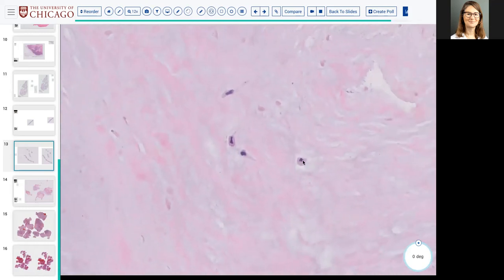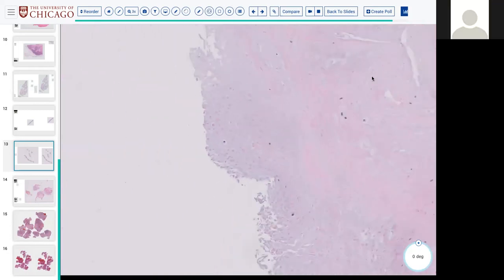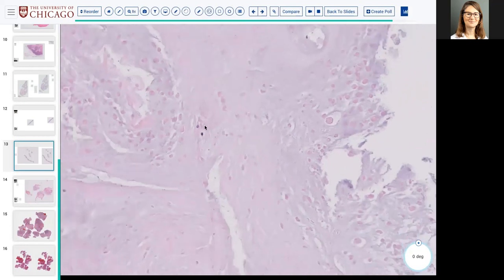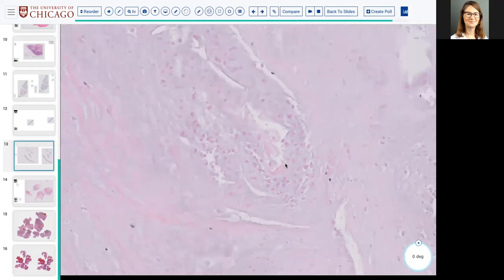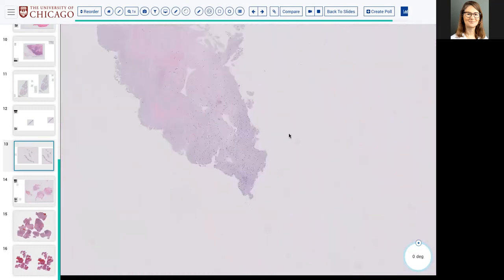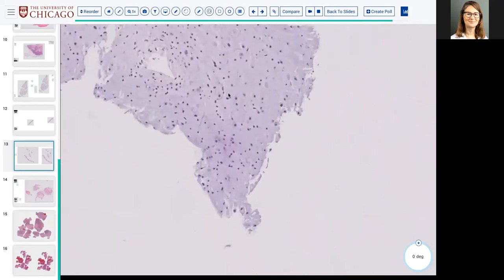And so here's the viable nuclei. And over here is an area where the nuclei are gone. And so these two, of course, are viable, but these pink areas are where the nuclei used to be. So yes, absolutely, you're dealing with necrosis. And necrosis in any primarily biopsied neoplasm that has never been touched by a human before, right, is worrisome. All right, so we've got necrosis and we've got a somewhat cellular area.